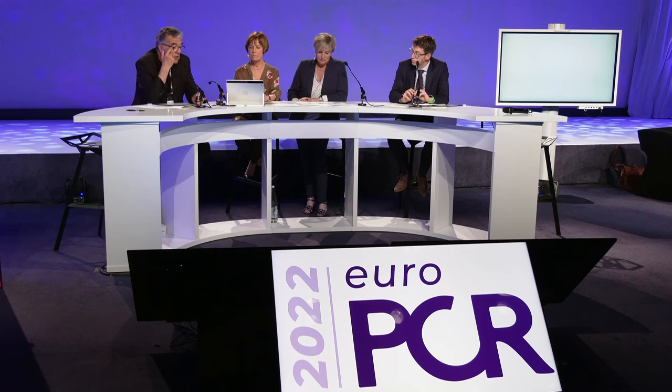That's the first point. The second, what is working well, when we have decided to perform a predilatation, we use the size of the balloon inflated in order to measure the real size of the vessel, particularly proximal to the balloon, and then distal to the balloon if the balloon is around 15 to 20 millimeter length. That's the two ways to size the vessel. I do not talk about intravascular imaging. That's another problem. But I think that today, with the quality of the standard coronary angiography, we can appreciate really precisely the size of the stent.